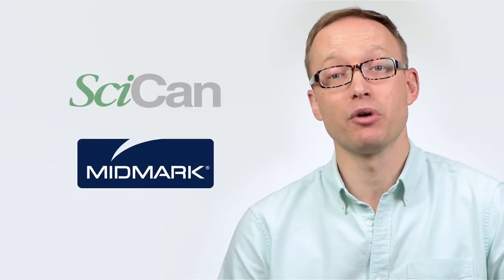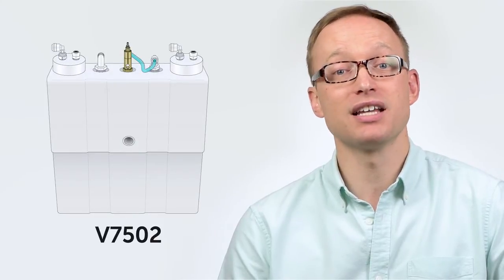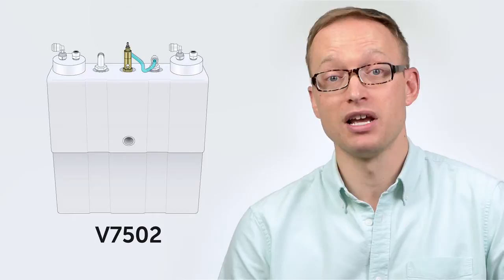Two VistaCool models are designed to accommodate either one or two autoclaves, and are currently distributed by both SciCan and Midmark. I'll be walking you through the installation of a model V7502 system designed to accommodate two sterilizers, but the process is essentially the same for both units.